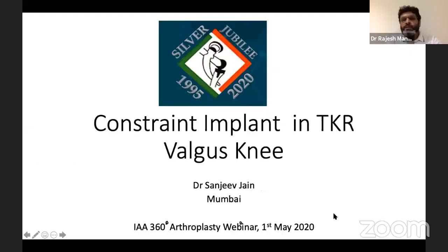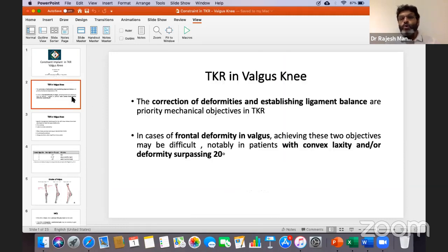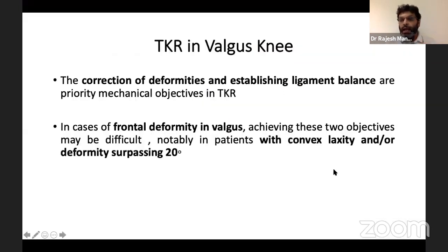So I think there is a problem in increasing too much, but I agree with you that if anything, you want to have a slight more external rotation, not the internal rotation. However, the problem of doing too much external rotation is the medial laxity in flexion. So I don't overdo external rotation. I put it wherever it is the best rotation based on the epicondyle and overall anatomy of the distal femur. And I rely on lateral retinacular release. I don't think there is any difficulty in doing that.